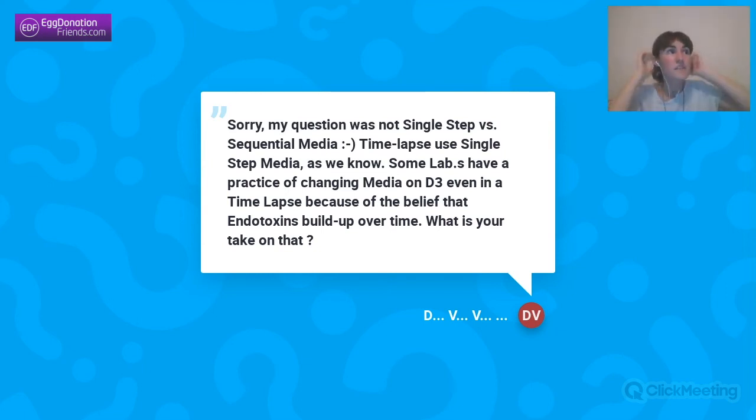Okay, so based on the results, I don't think there must be a lot of endotoxins floating around affecting the embryo development, because we have good results, and we're not changing the medium on day 3. But my guess is, since there is so much media in the dish, these endotoxins are really diluted. But it's an interesting thought. I'm guessing there are lots of studies about this, and well, if it's the case, it could be an addition to the practice.